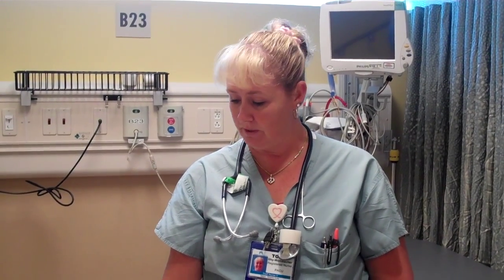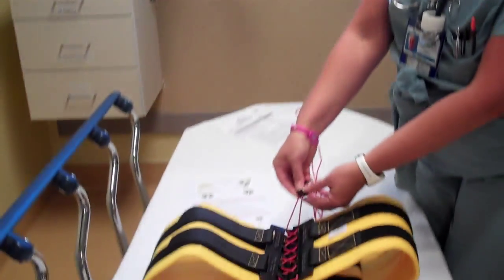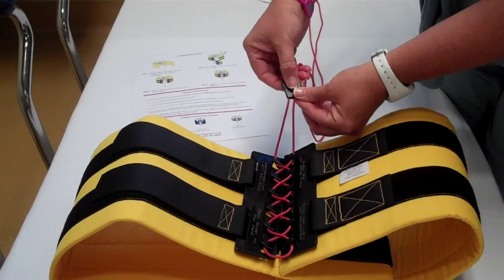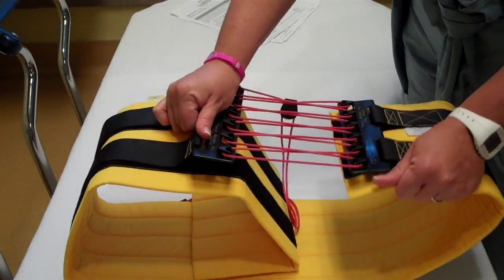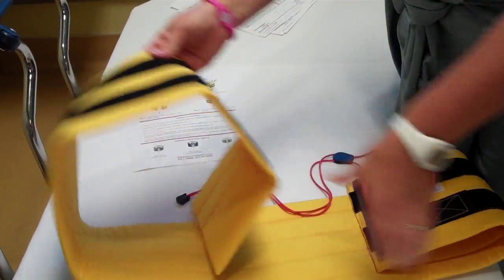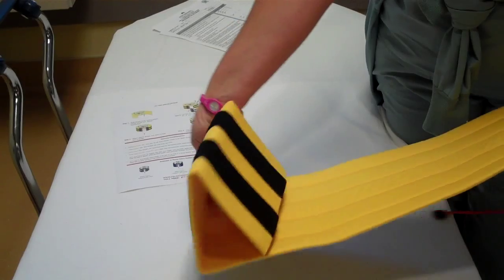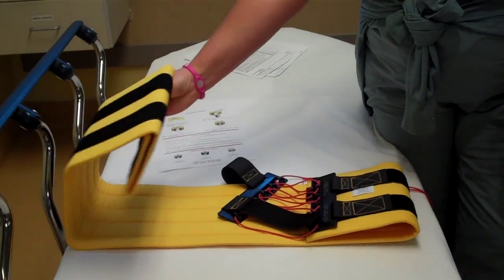Never remove a pelvic binder without a doctor's order, because of the blood that can be sitting in the pelvis at that point in time. To remove, if you were to remove, you just pull this piece up like this, pull the string all the way back, and pull it apart. Make sure you have enough room, undo the straps, and then you can pull it out from underneath the patient — it should slide. Or you can cut it off, and then it goes in the trash.